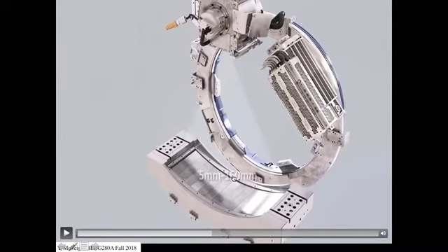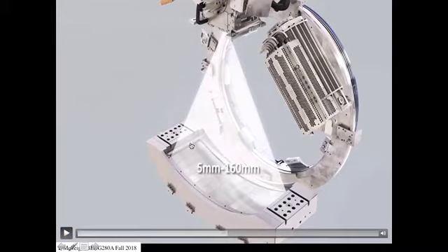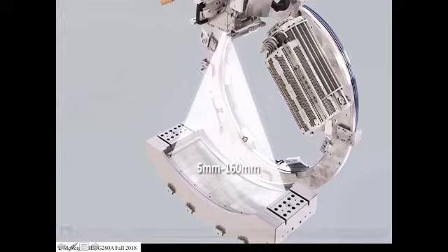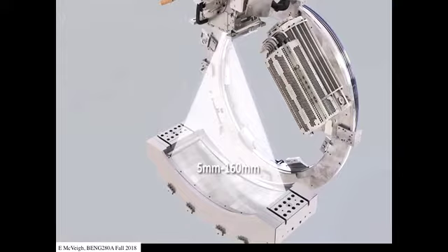And so the detector has enough length in this dimension such that if something is at the center of the scanner, we can cover 16 centimeters, okay, in the center here. And so that goes out to about 20 centimeters down here. And so there's, I think, 832 pixel elements in this dimension. So that's like the theta dimension, right? And there's 256 in the z dimension. So you're getting 256 slices of the patient simultaneously, right, as we're doing this imaging.